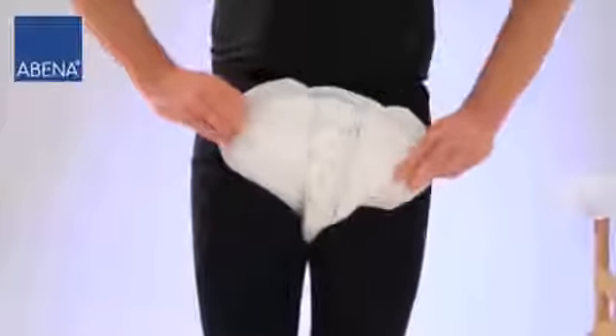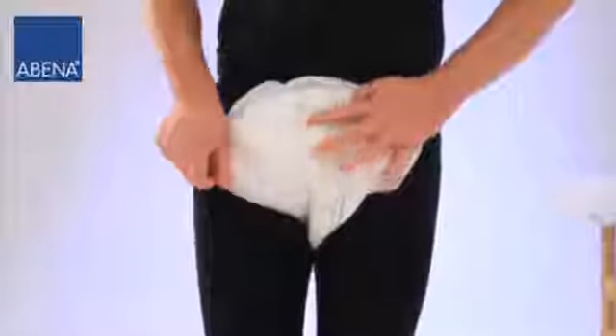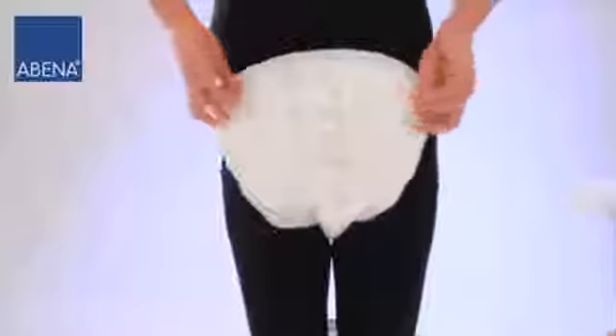Please ensure that the wetness indicator stands parallel to the perineum and that the back side of the pad is at the same height as the rump. Stretch the pad widthways.